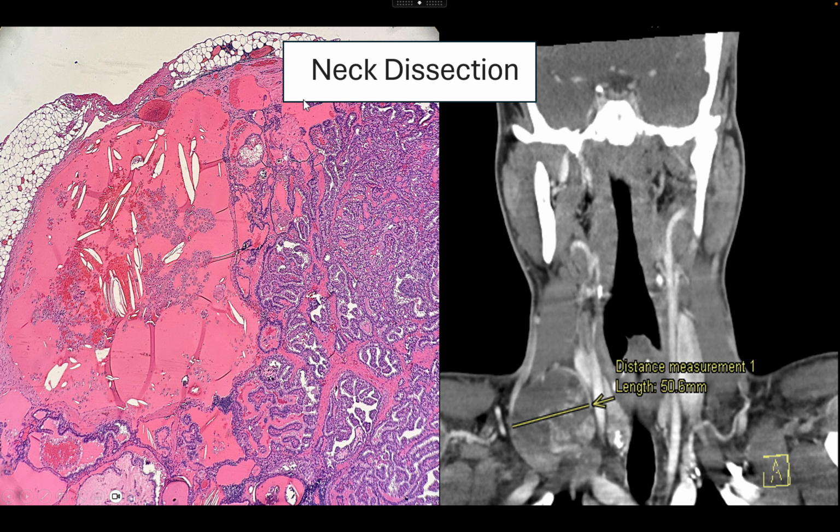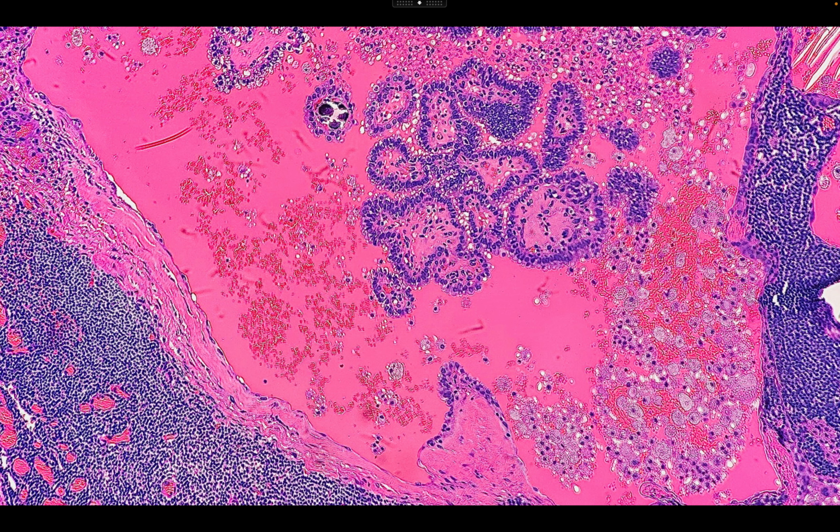Here's the corresponding histosection of the supraclavicular cystic mass. And I demonstrate this field of view to show you, if you sample just this area here, you might get a non-diagnostic result. So it's very important that sampling is done on the solid regions as well, and to get that metastatic PTC portion.